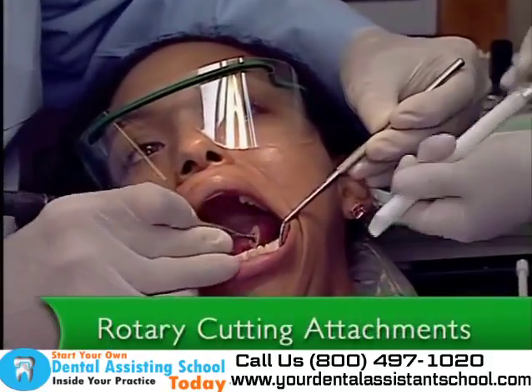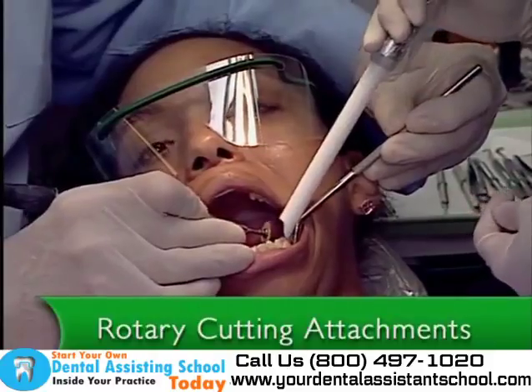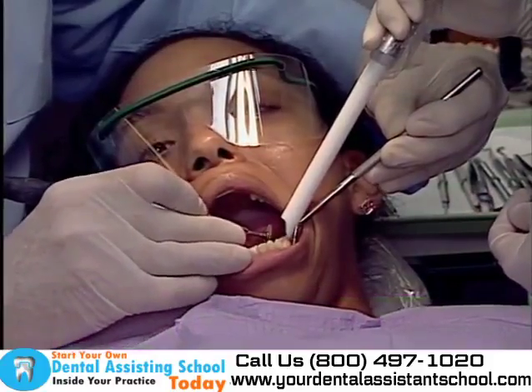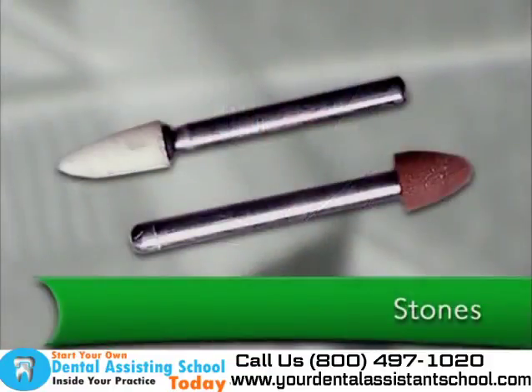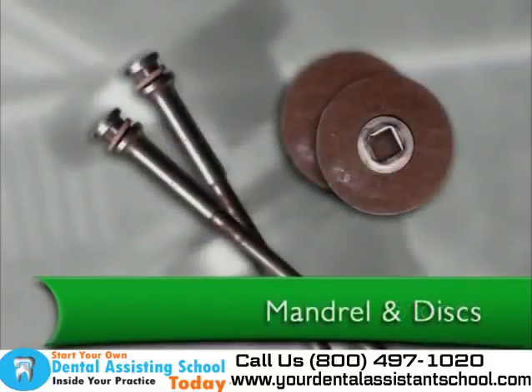Rotary cutting attachments are mainly used for cutting, polishing, and finishing a tooth. Rotary instruments include stones for finishing a composite. Stones come in many different sizes and grits or levels of abrasion. Mandrels are steel shanks that hold wheels and discs for the handpiece.